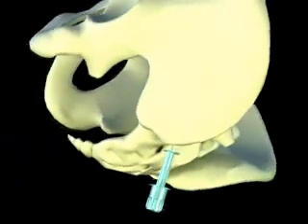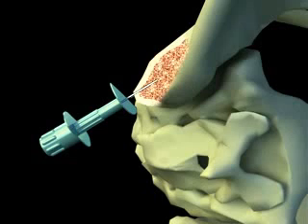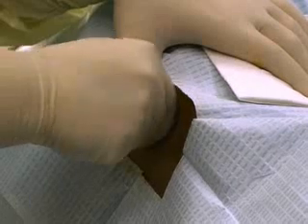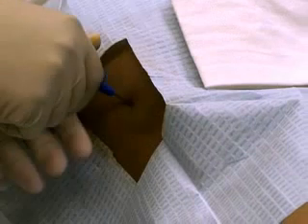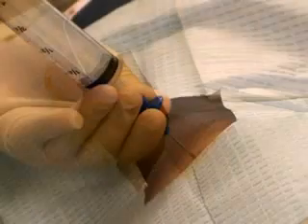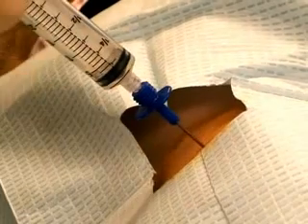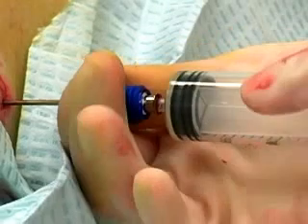The ilium is a large bone and the marrow space should be located easily. However, the angle of entry is important. In general, the needle should be advanced at an angle completely perpendicular to the bony prominence of the iliac crest. Once the needle is through the cortex and the marrow cavity is entered, the needle should stay in place without being held. Next, remove the stylet. Attach a 30-milliliter syringe without heparin and aspirate 1 milliliter of marrow with a firm pull.